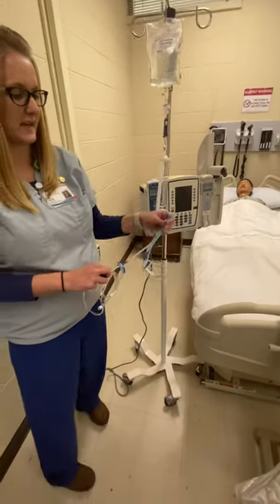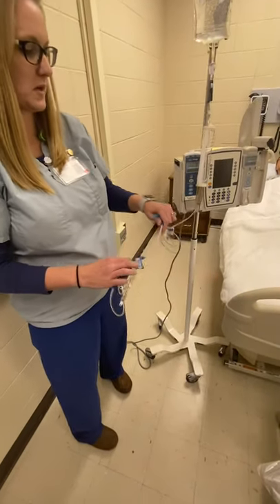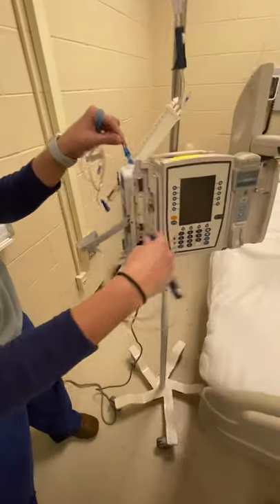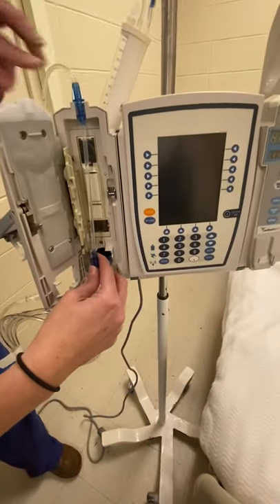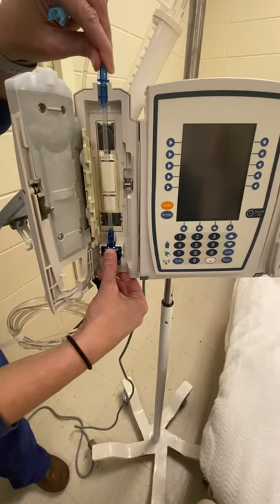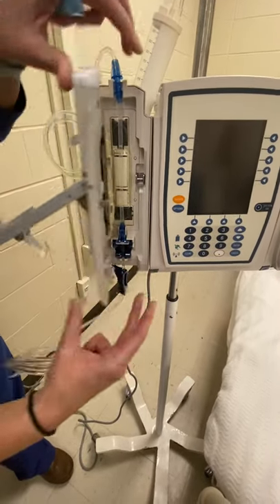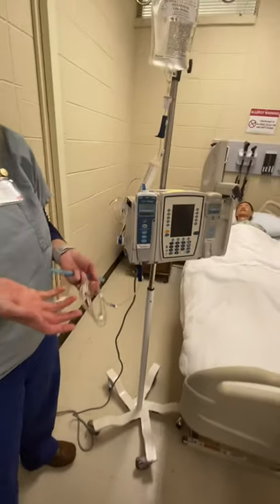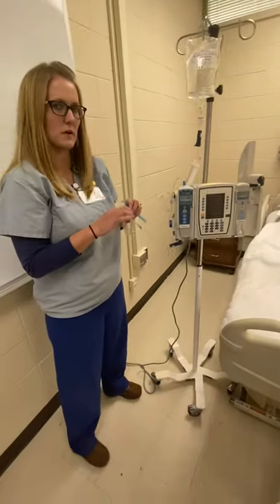I'm going to take off the blue port, and now I can load this in my IV pump like so. This goes on the top, this clicks in there to close our door, and we are ready to give an infusion through our buretrol.